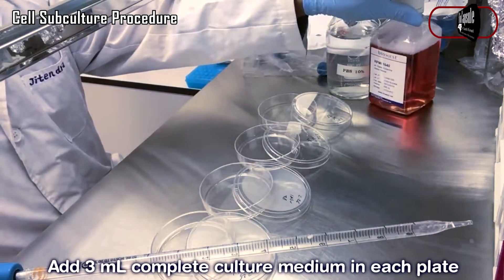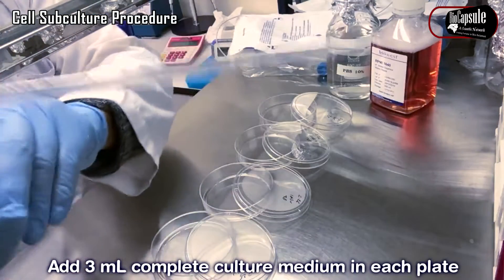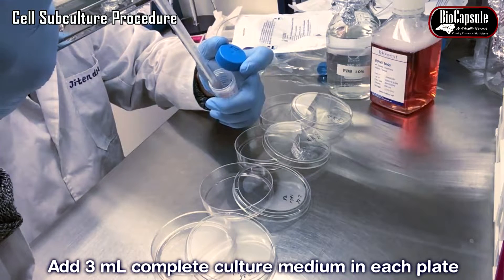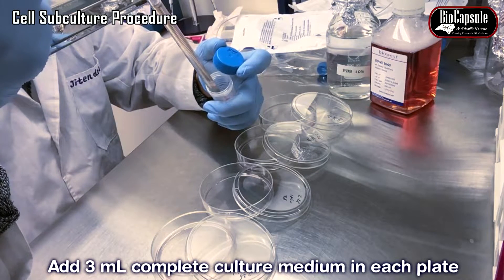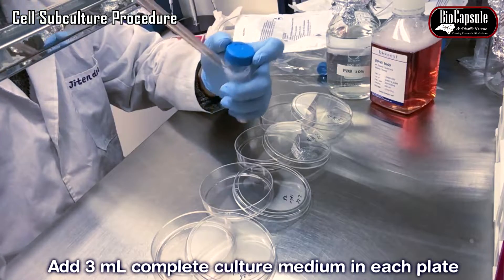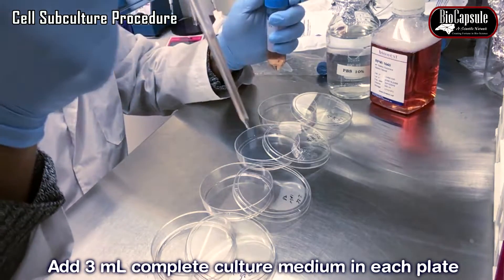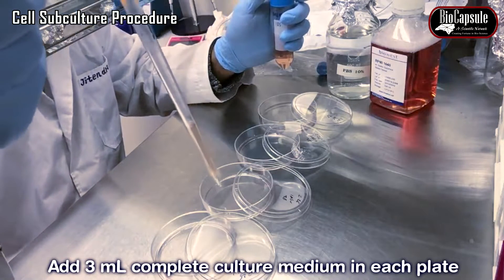If the cells are completely detached, add 3 ml of medium. Usually the volume of medium is three times the volume of trypsin, in order to inactivate the function of trypsin.